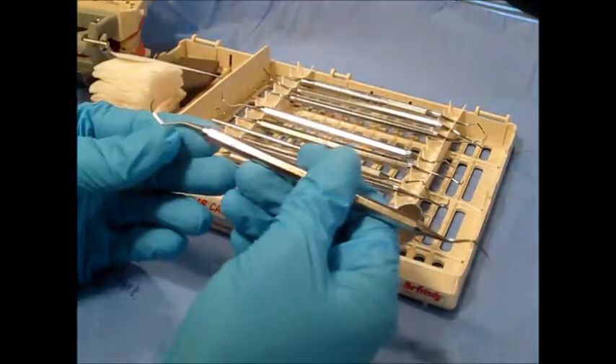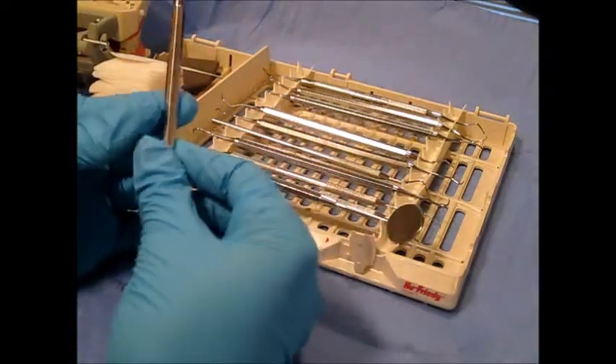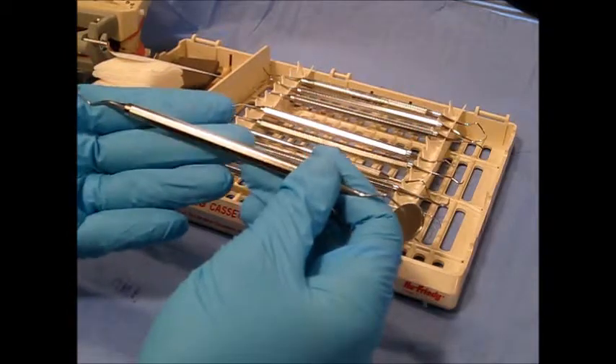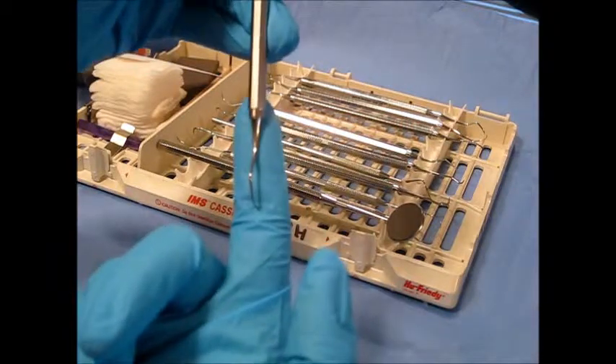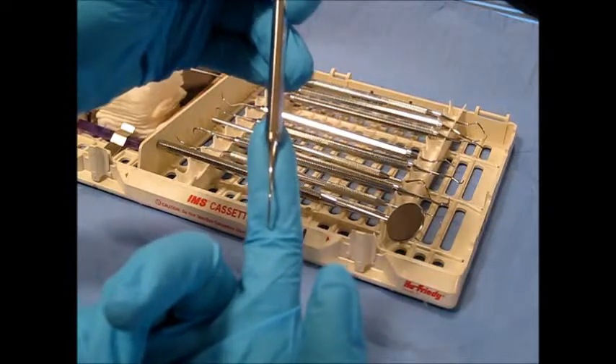This is the Gracie 7-8. It's a debridement instrument, and specifically it's known as a curette. It has a simple shank which is moderately flexible, meaning that it's used to remove light to moderate calculus.